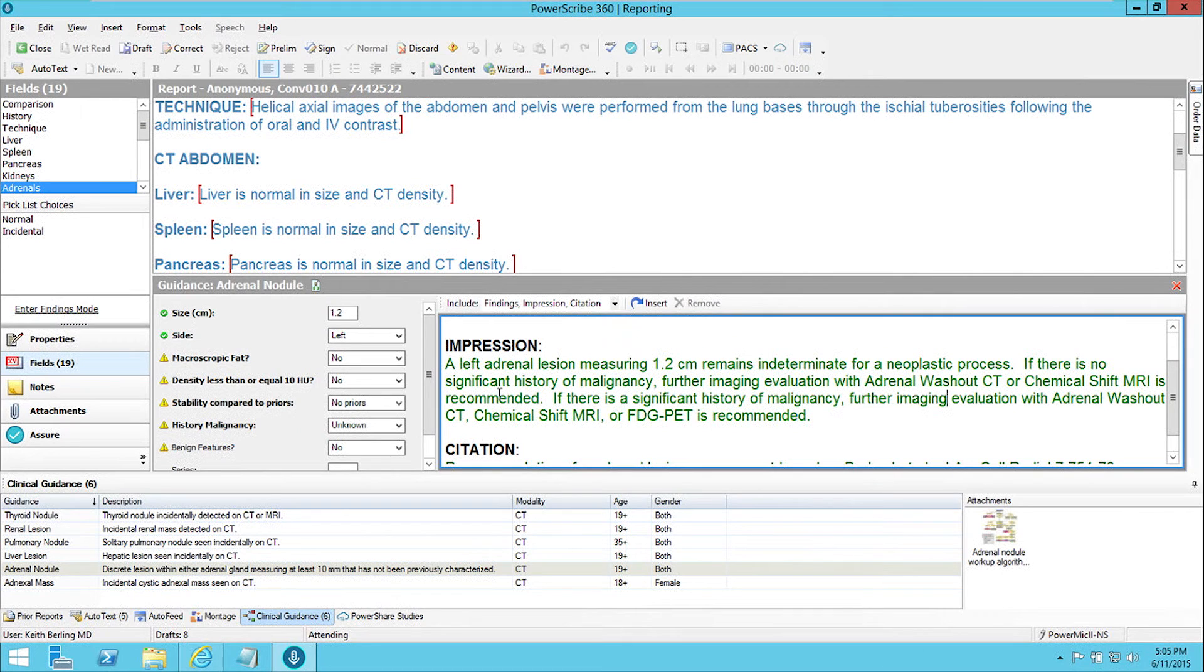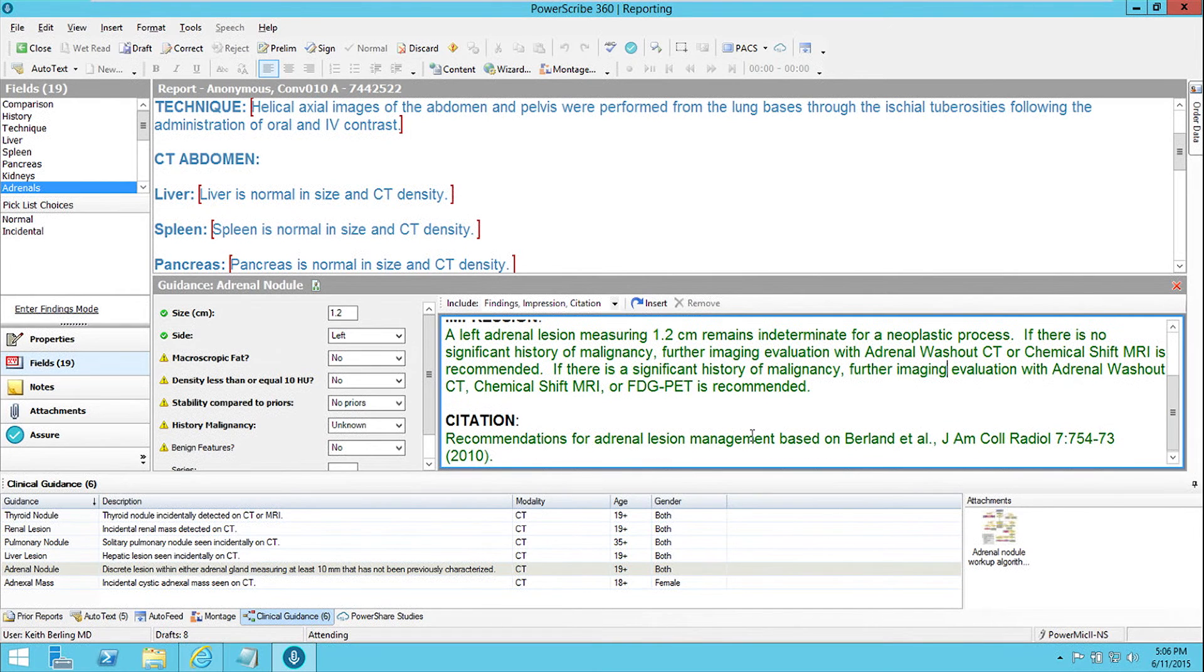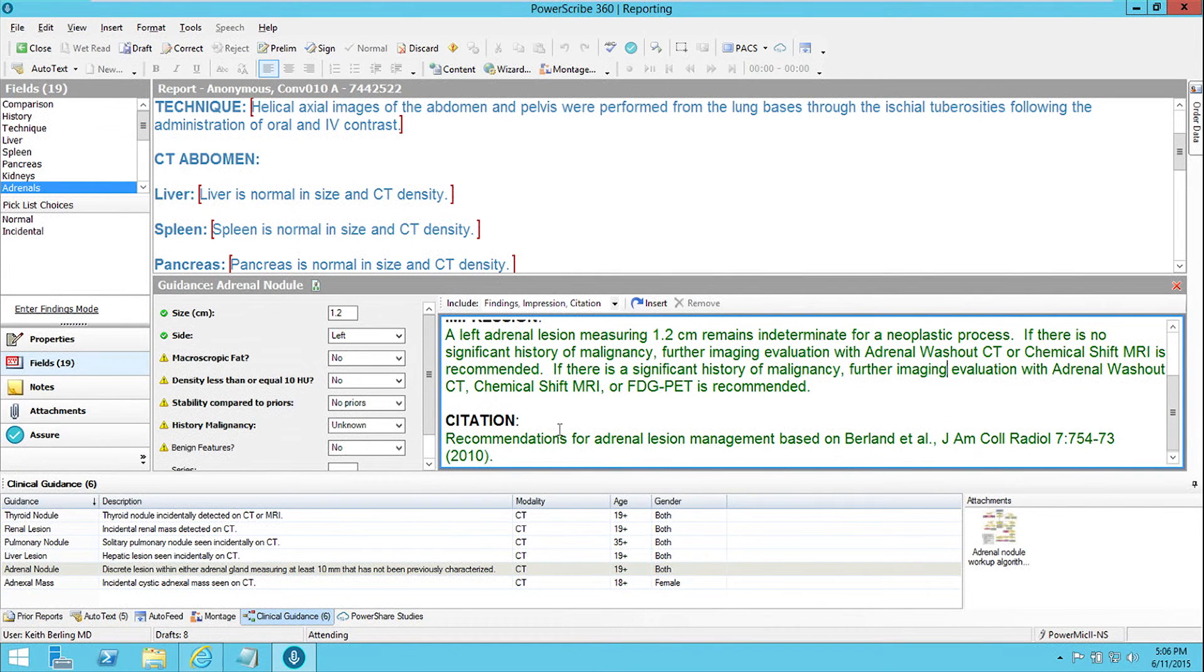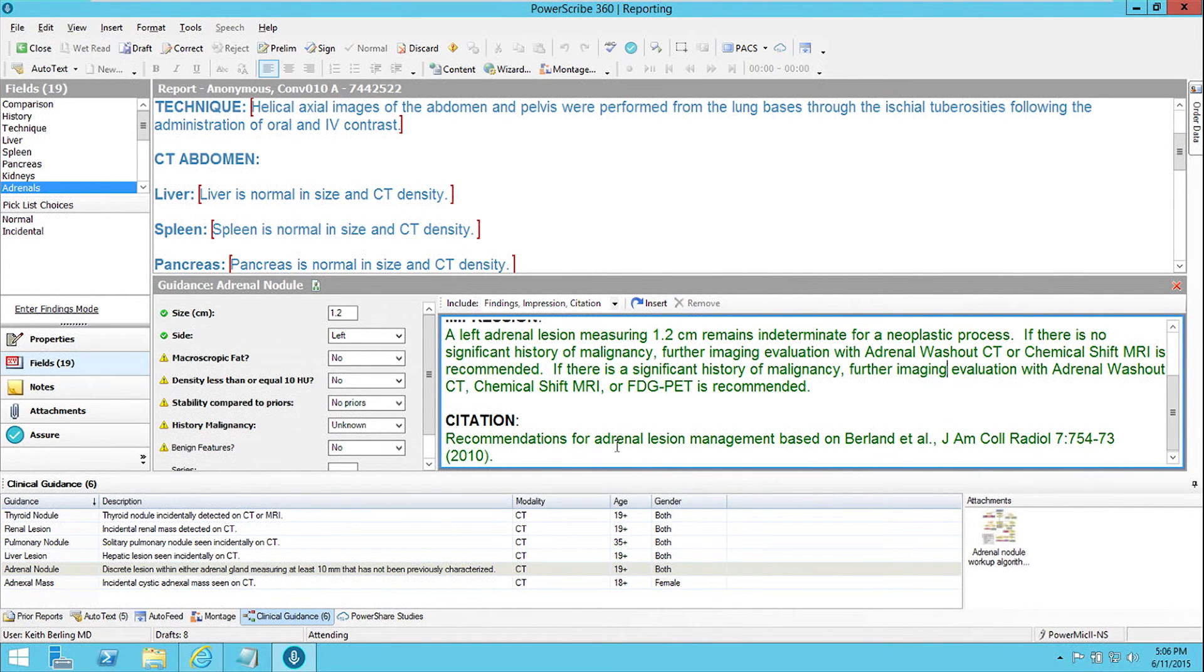If there's no significant history of malignancy, further evaluation is recommended. If there is, further evaluation with adrenal washout CT is recommended. And it inserts a citation saying where the recommendations for adrenal lesion management came from.